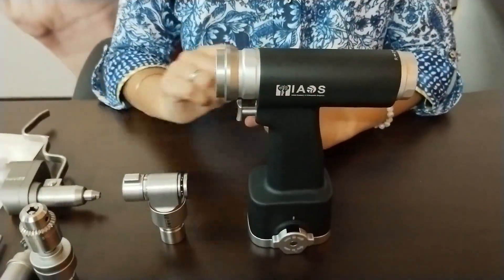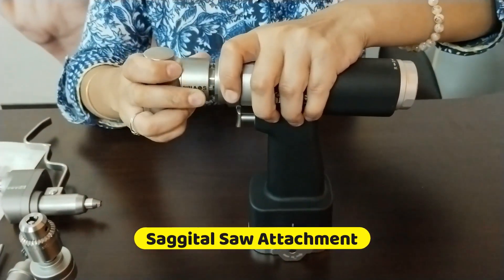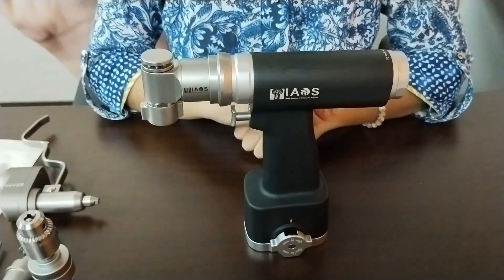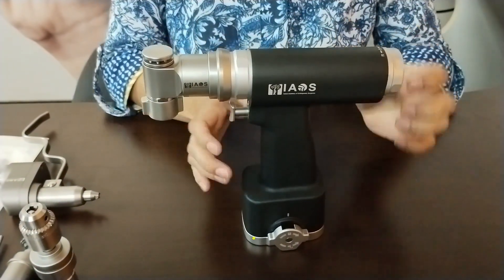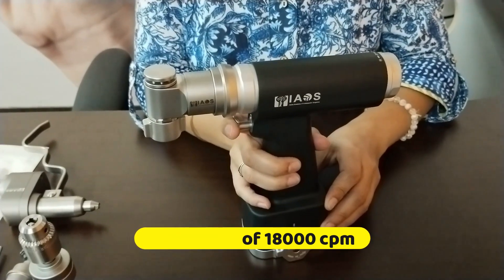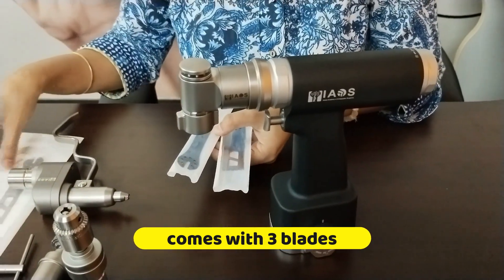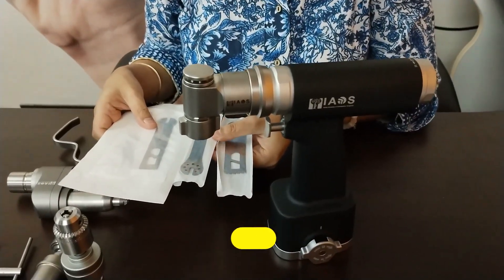Next is the sagittal saw attachment. You push back the collar lock and with a snap it fits. The technical specifications are a frequency of 18,000 CPM. This is used for joint surgeries. Here are the three blades which can be attached to the sagittal saw.